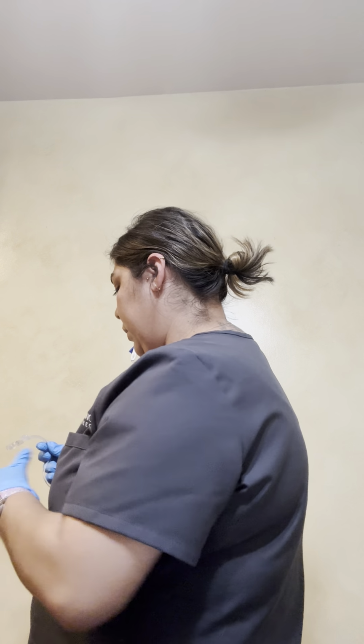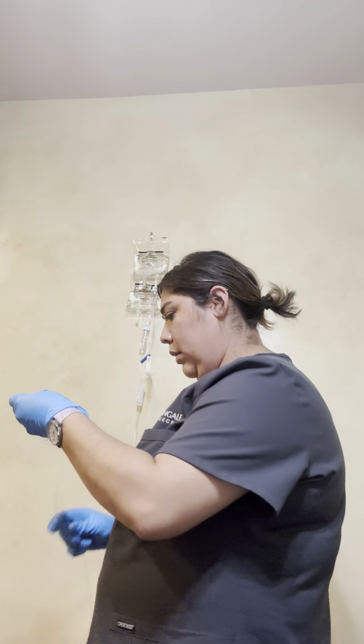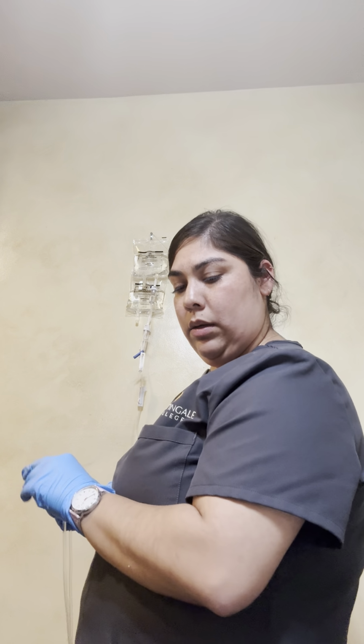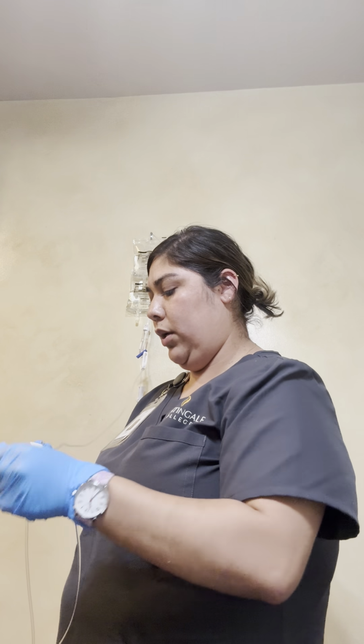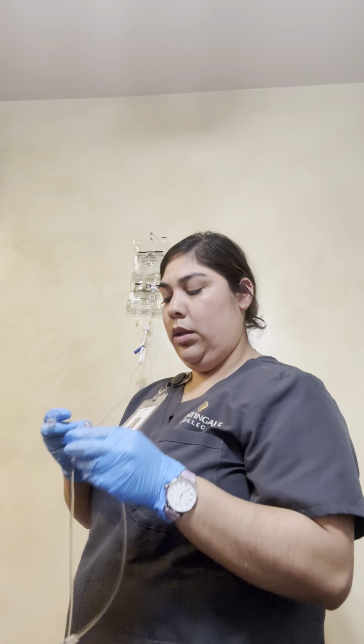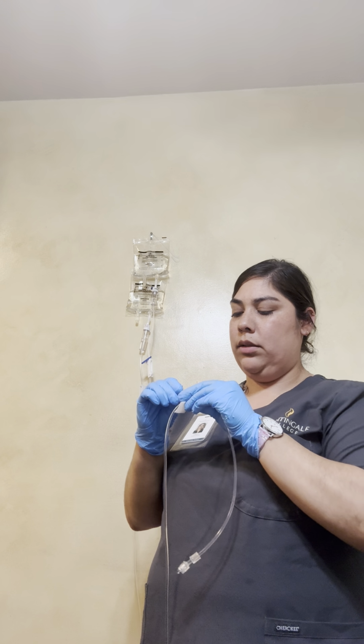And so now we would want to connect, and we would want to make sure we unscrewed this. We're going to get our other clean alcohol swab to swab the white port, and we're going to go ahead and connect.